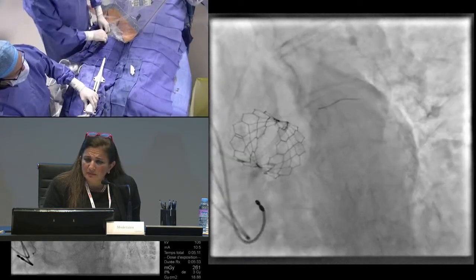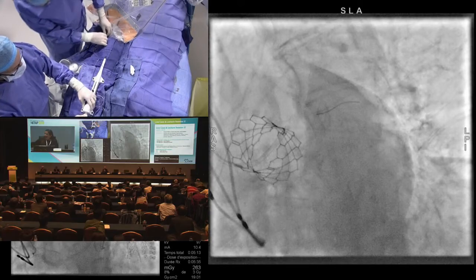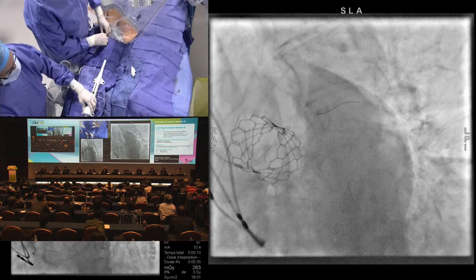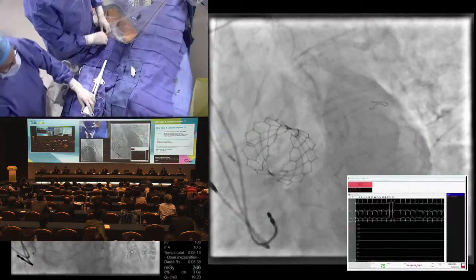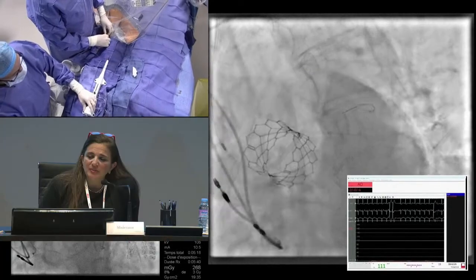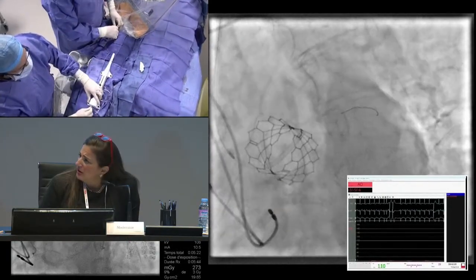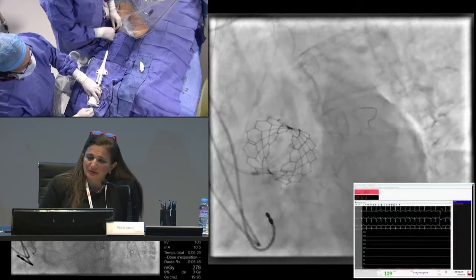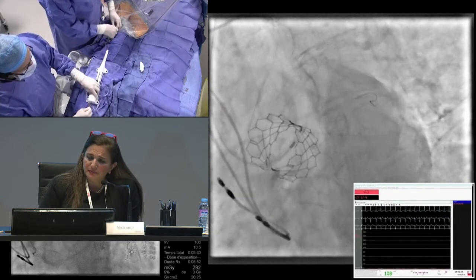Advance the wire. Do you have a kind of backup for hemodynamic support? Okay, so we advance the wire during the Dynaglide. Pull back a little. So one question was about hemodynamic support, but I guess you have very good LV function. Yeah, it's 45% ejection fraction.